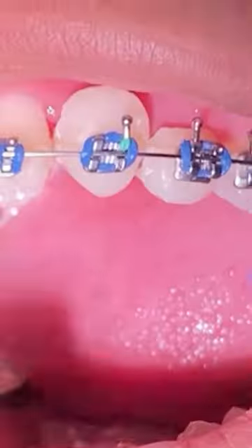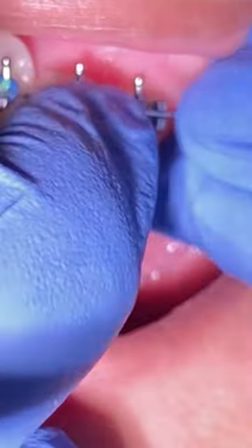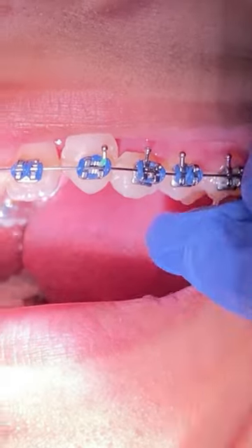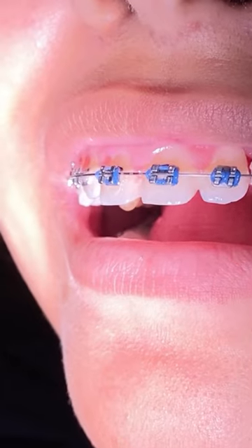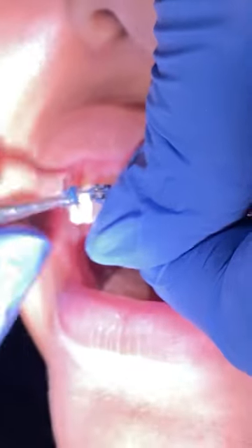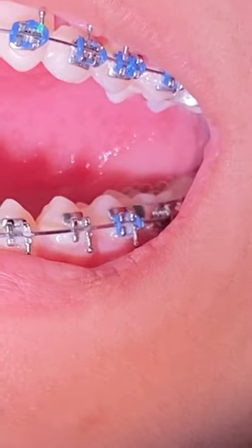This patient had a special event going on and didn't want the space to show. So we went ahead and made some fake teeth to cover that space for some pictures, to make sure she has a really great night and feels a little bit more confident in her smile.